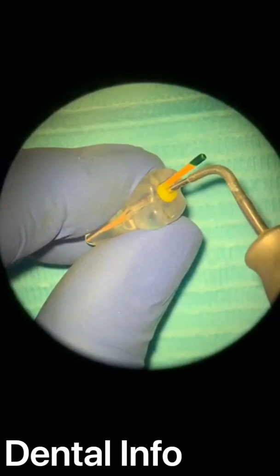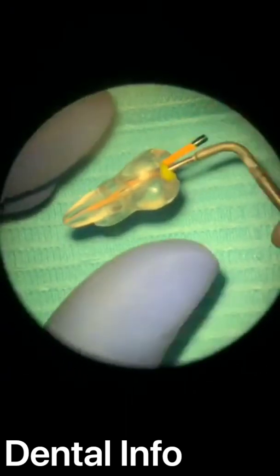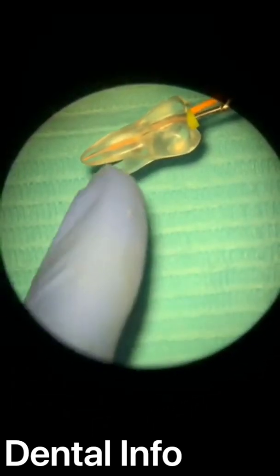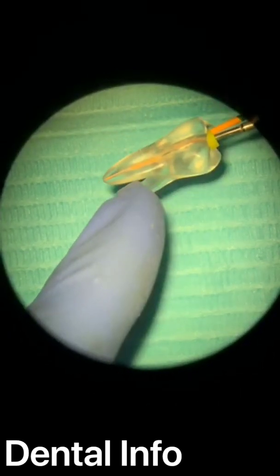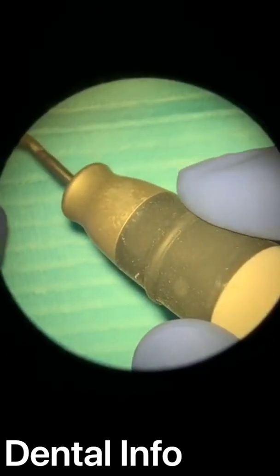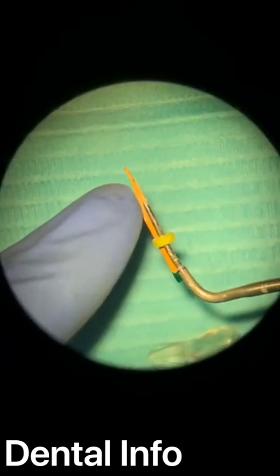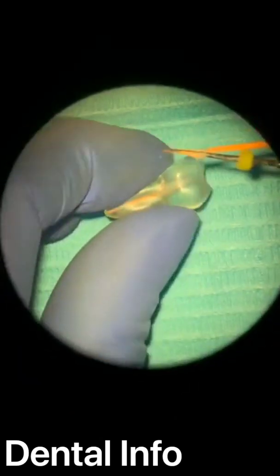Here, I will stop. Okay, I reach the stopper. I will wait for like 5 seconds, and here I'm removing my finger. I'm not doing anything. I'm giving it time to cool down. Now it's cool. I can go out, but I will not go out with cold tip. I have to activate and go out. See? The gutta percha will go out like this because the rest is left here in the canal.